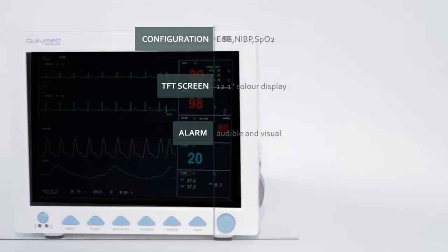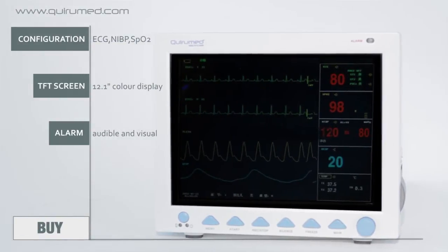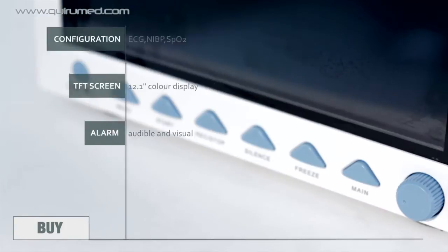The Constant Vital Monitor 550-8000i by Curumet works with the functions of electrocardiogram, non-invasive blood pressure, and SpO2. It features a TFT 12.1 inch color screen and has both audible and visual alarms.